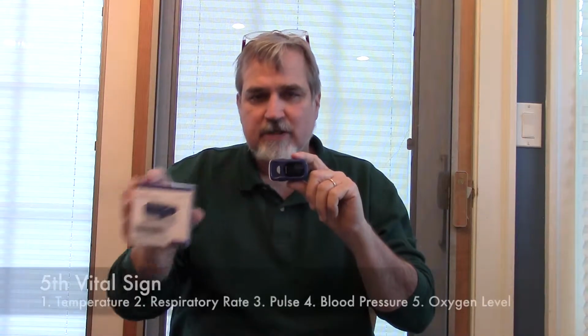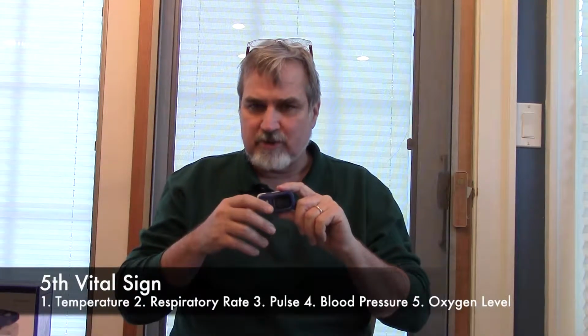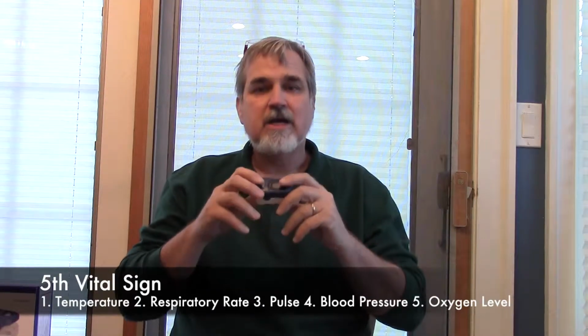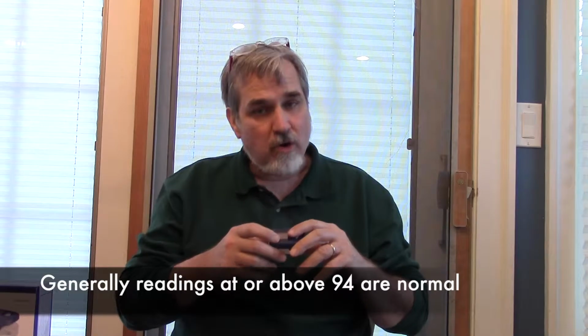Number one, it's called the fifth vital sign. That means temperature, respiratory rate, pulse, and blood pressure, and the fifth vital sign ends up being an oxygen level reading. So this tells you what your oxygen level is in the blood. Generally, anything at or over 94 is normal. But oftentimes with asthmatics, it starts out low until you've given nebs and see what happens.